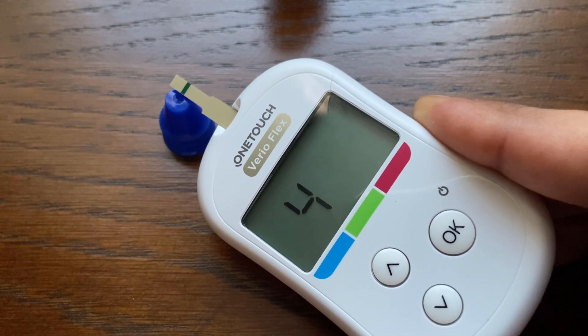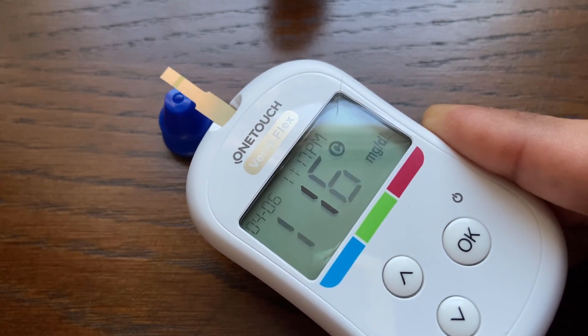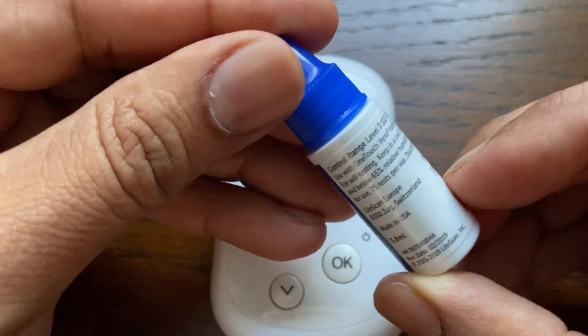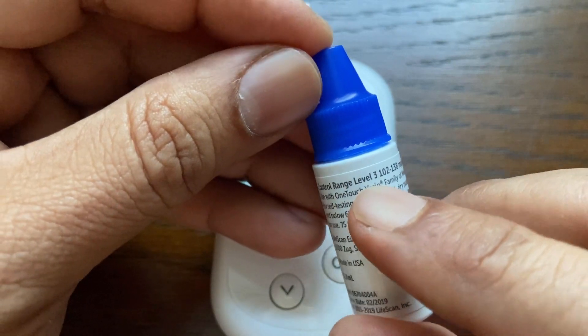The meter counts down for 5 seconds before the meter displays the control test result. Compare the result displayed on the meter to the range printed on the control solution vial. The result should fall within that range.